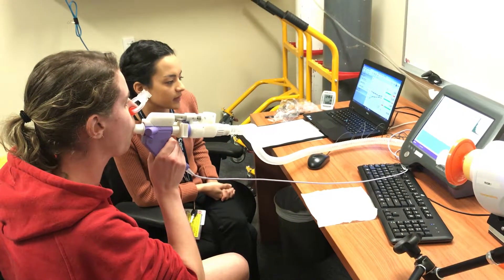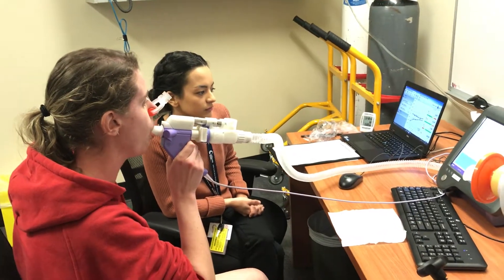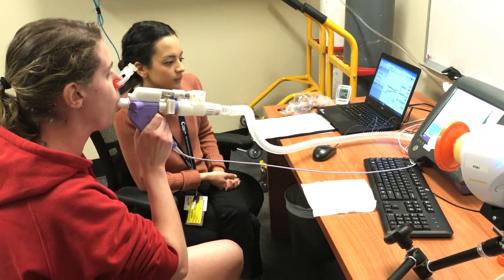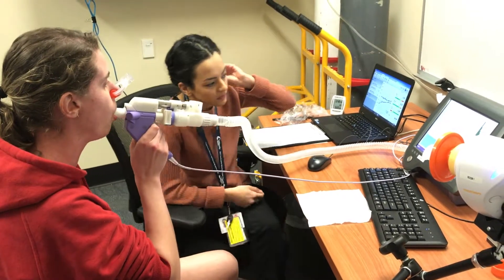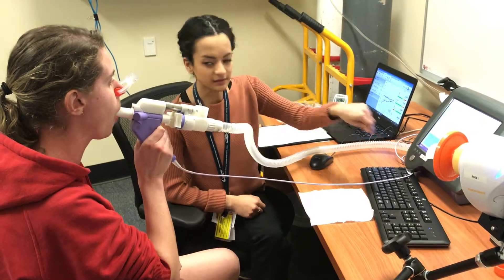Beautiful. Aiming for that range. Doing very well. Come and have a rest, Esther. Doing well.